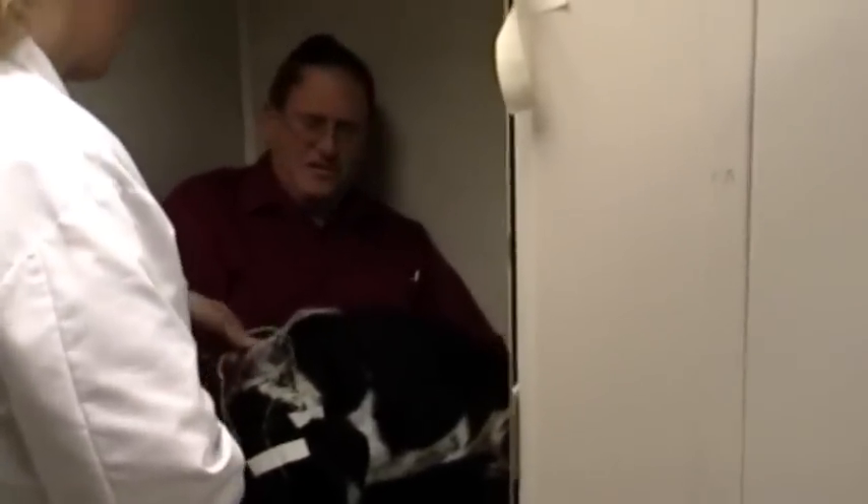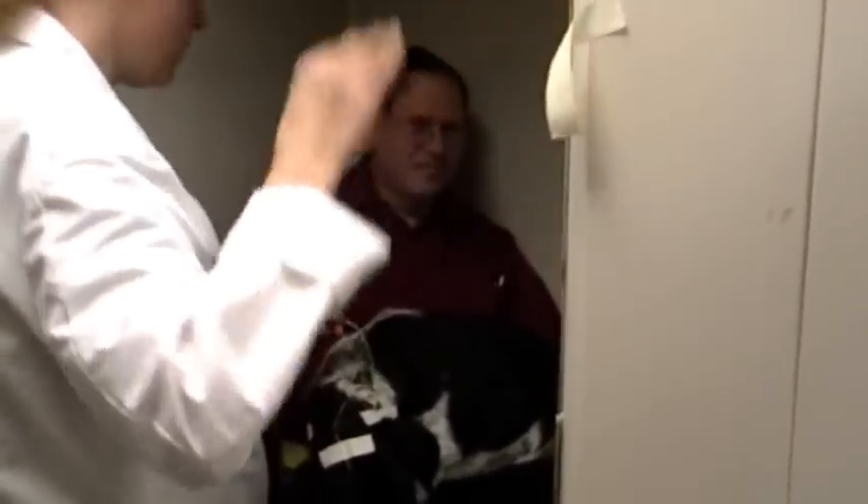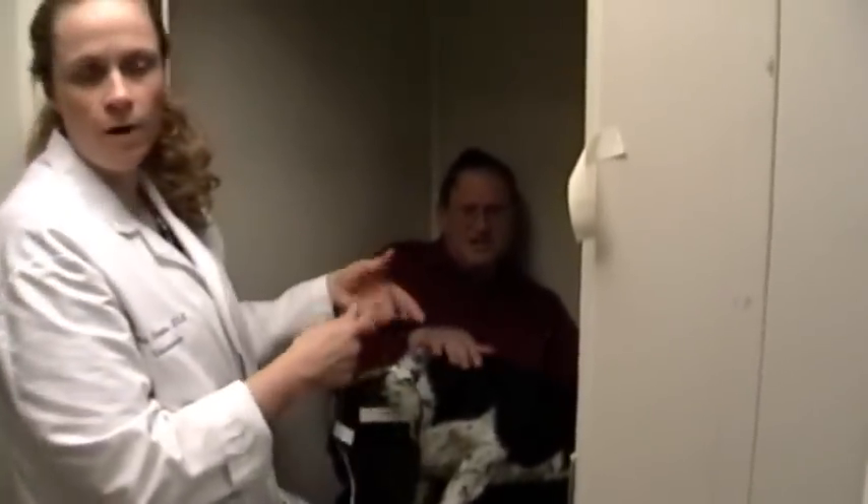They will let you know what you need to know. I'll just hook him up. We weren't getting anything at 50, so let's go up to like 80 — well, we'll go to 86. Okay, everything's in. Do you want to grab the box for me?